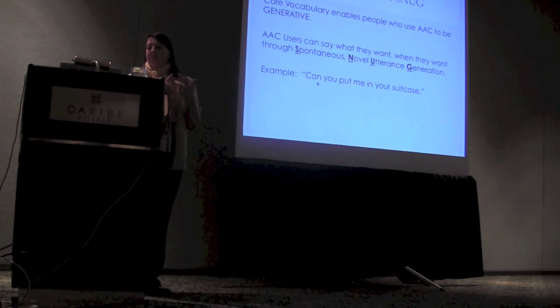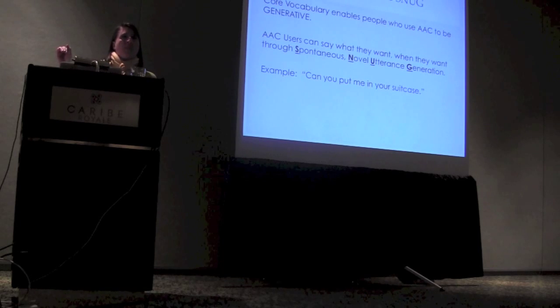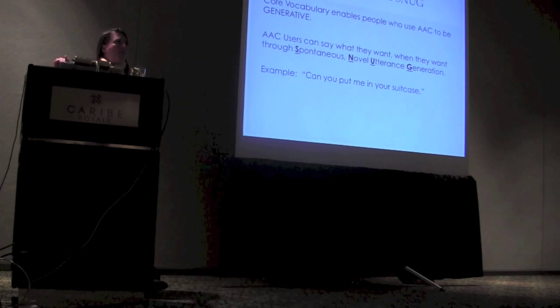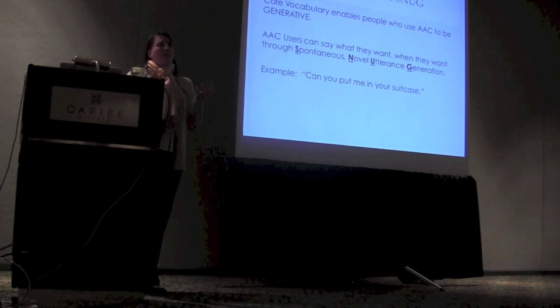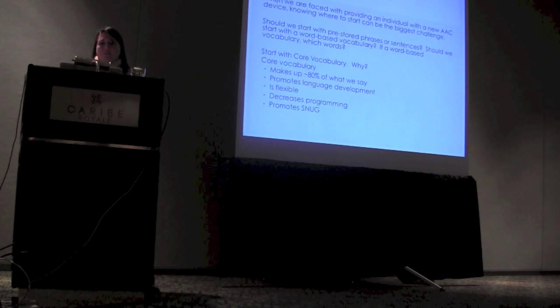And he's a little boy. You think about, can you put me in your suitcase? That was a lot of clicks on Unity 45. But he has the language skills, because if you look at those first 6 words, those are all core words, right? Now, if he only had suitcase in that utterance, we might not have known what he meant. What provided the richness and the context of his intent was the "can you put me in?" Basically, take me with you. But because he had a focus on core vocabulary, and he's got the language skills to do that, he's able to show his personality and participate in conversations.